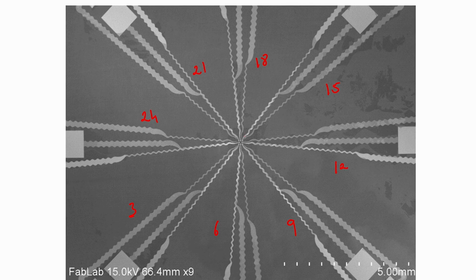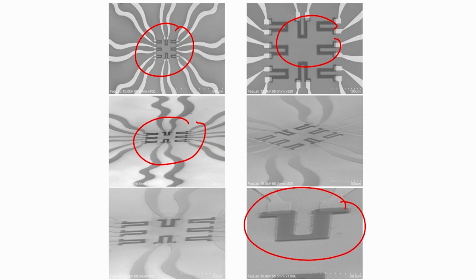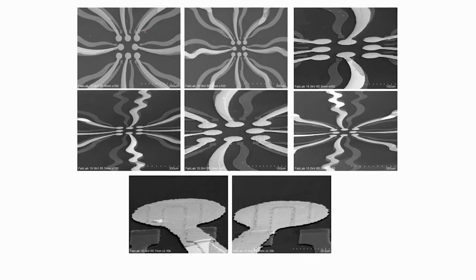And how many piezoresistors and electrodes are here? 8 piezoresistors and 8 electrodes. Okay. You can see here now we have a strain gauge, an array of the strain gauge, this is the top view, the cross sectional view of a strain gauge, this is a SEM image, and you can clearly see a single strain gauge, right. Now, these are gold pads, you can see gold pads on insulator on strain gauge. So, what does it mean?